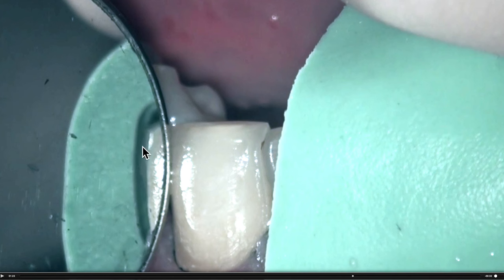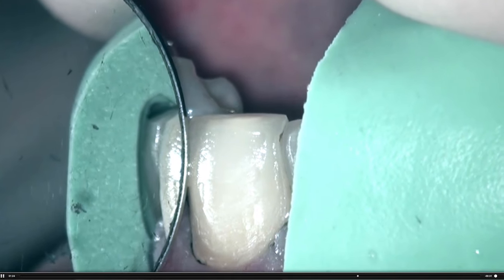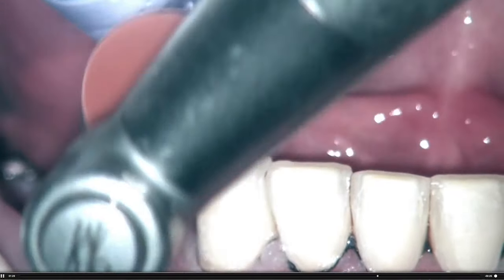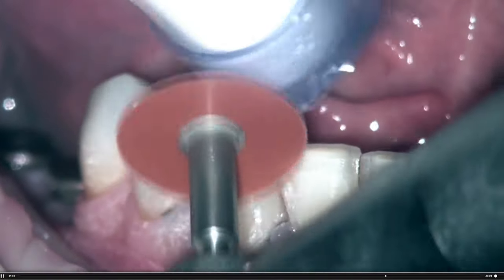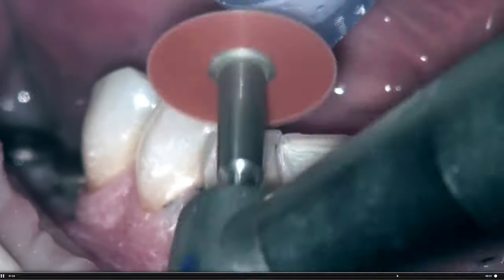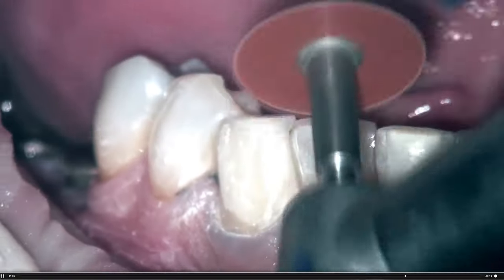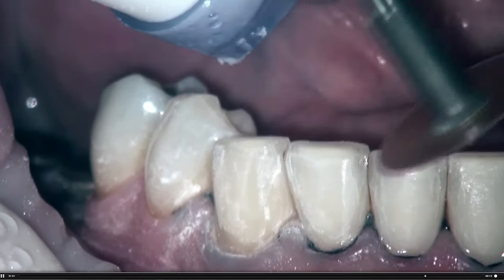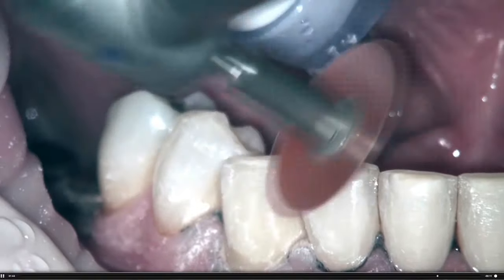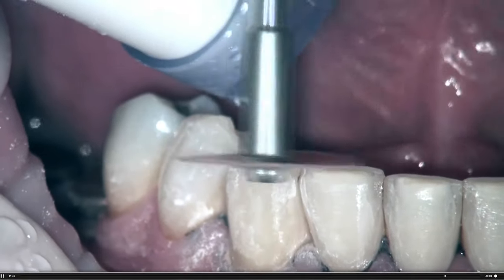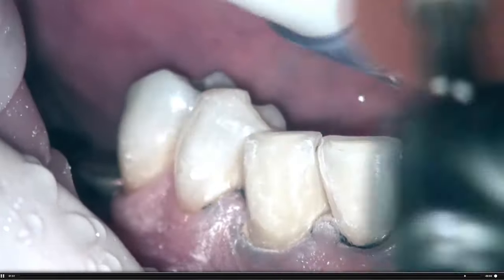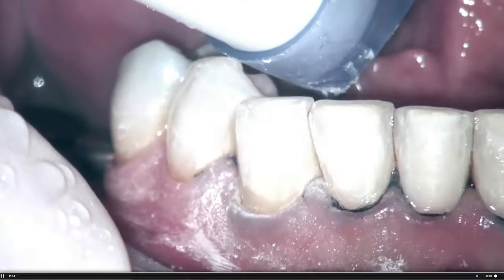This sharp corner is what the ceramists are telling me they're seeing, and I'd like you just to smooth that out as the final step in the preparation. So I like to use these soft flex discs. They're good at smoothing the preparation, and I'm just kind of rotating it around that incisal-facial edge. That just gives me the rounded contour that we're looking for.